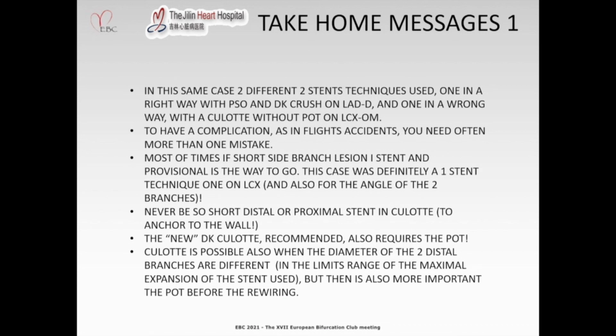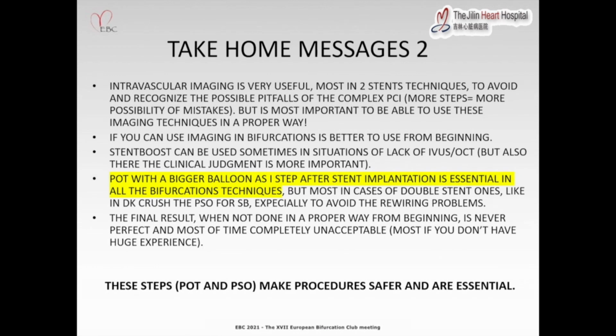The new DK culotte recommended also requires the POT. Culotte is also possible when the diameters of the distal branches are different, within the limit range of the maximal expansion of the stent used, but then the POT before the rewiring is even more important, it is essential.